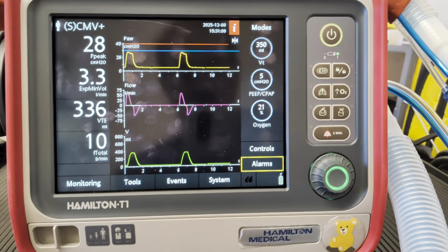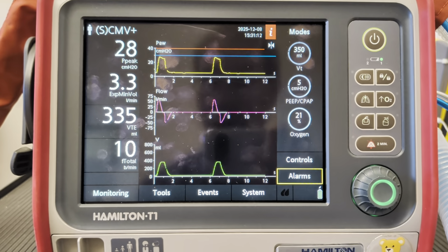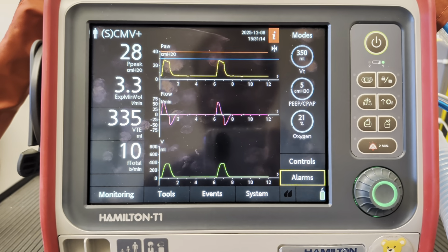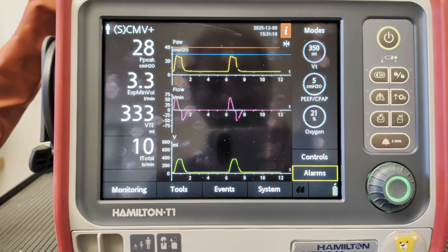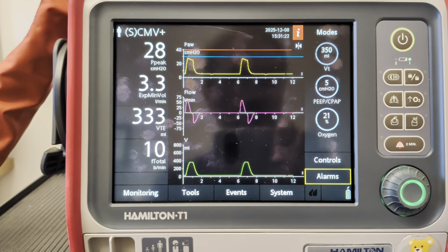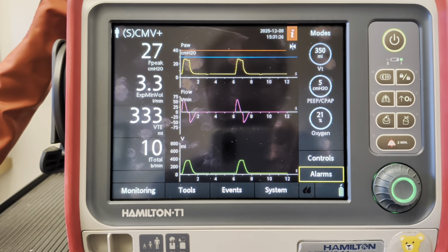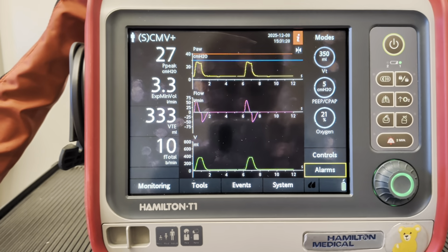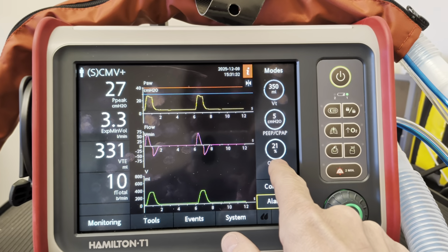So when it comes to oxygenation, improving the patient's oxygen levels, getting more oxygen into the pulmonary system across the alveolar capillary membrane and loaded onto hemoglobin, right? What are the primary variables that allow us to do that with the ventilator? One of the most obvious variables is the FiO2, right?